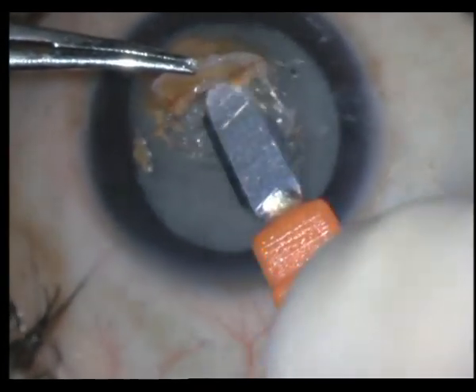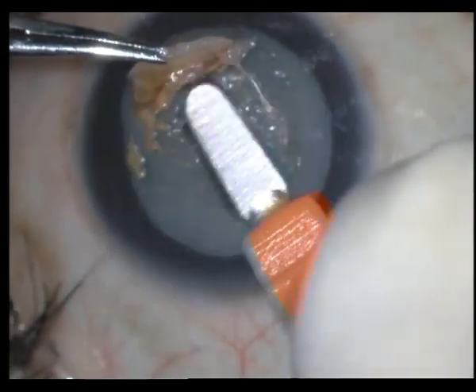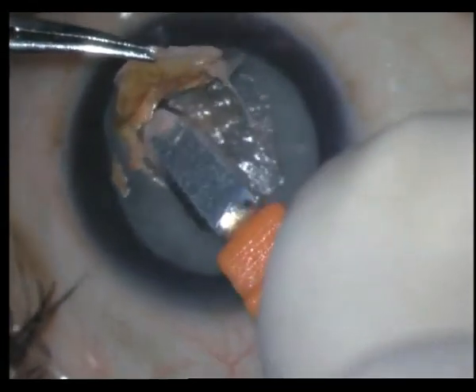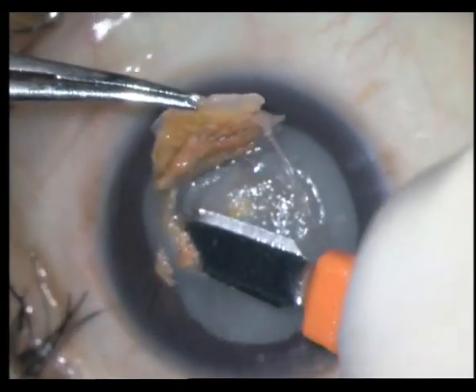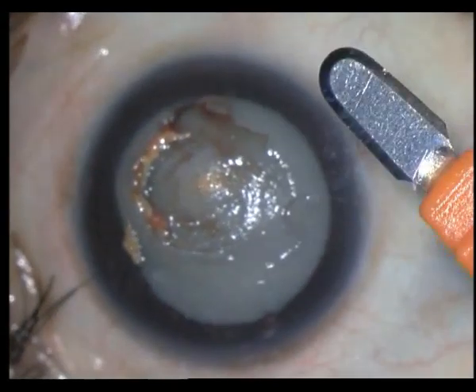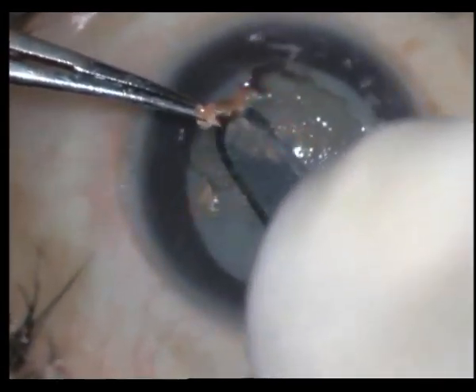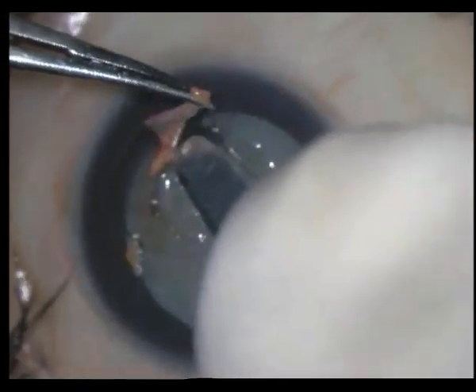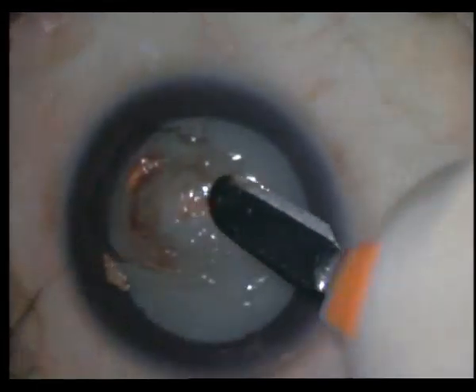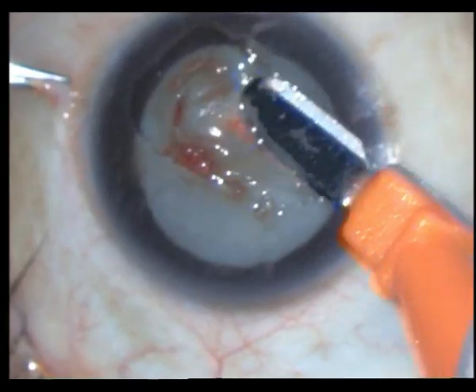In fact, that's what happened in the other eye — the fellow eye — and we're hoping the same will repeat here, although we did tell her that we may need to do a transplant in this eye later. It's always a good idea to handle the cataract in a closed chamber first, and later on do the corneal transplant. I do not like to do cataract surgery in an open chamber.